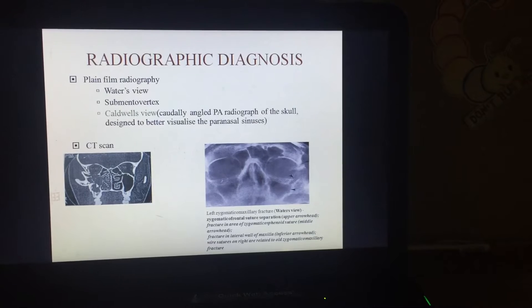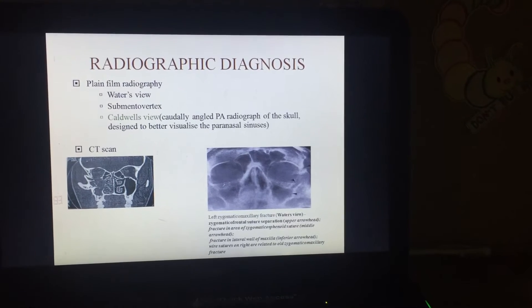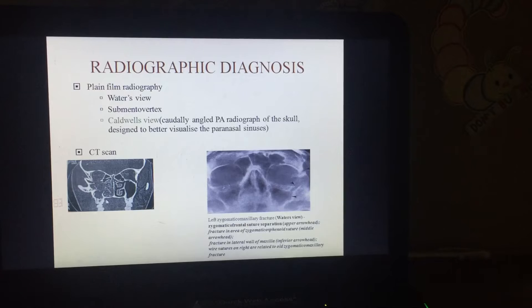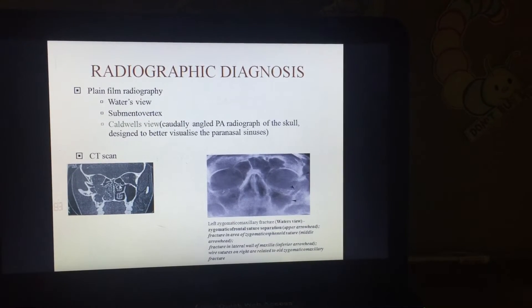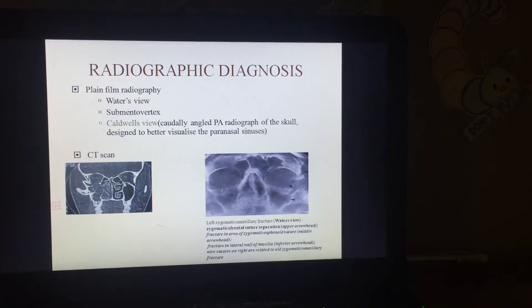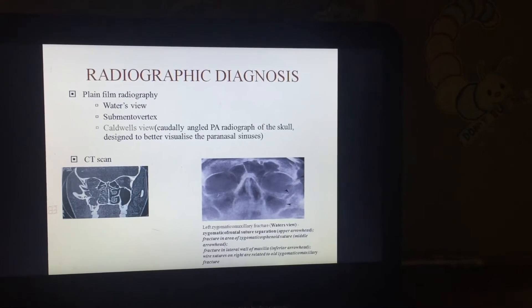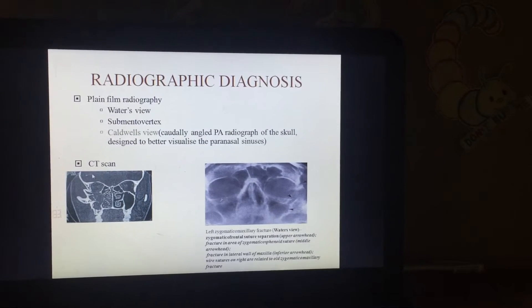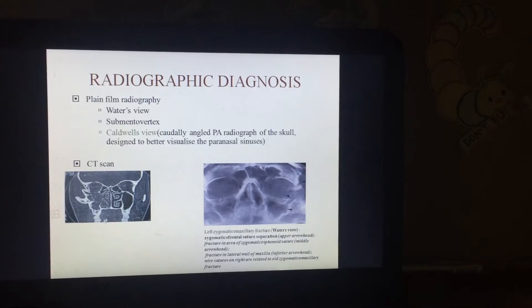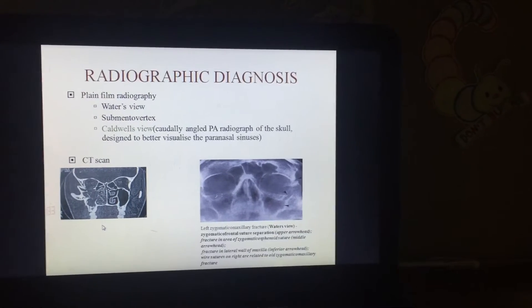The area is filled with blood, and even the nasal cavity is also filled with blood. The blood is visible as haziness, which we try to correlate with the haziness on the affected side. On the normal side, there is no haziness in the nasal cavity and the orbital floor is intact. We look for haziness as well as fractured or shattered bone areas.